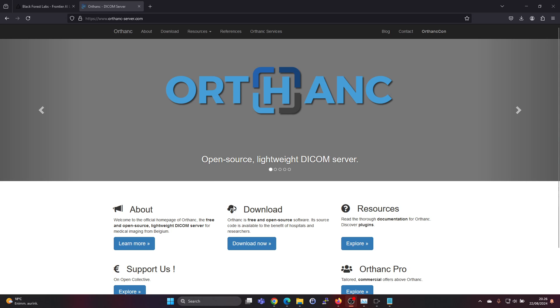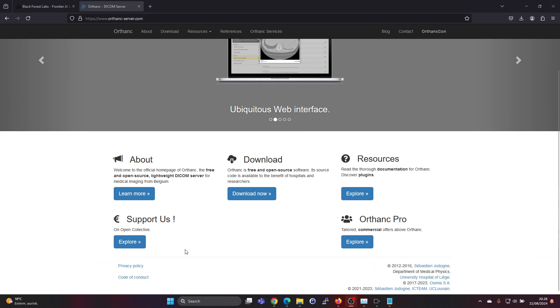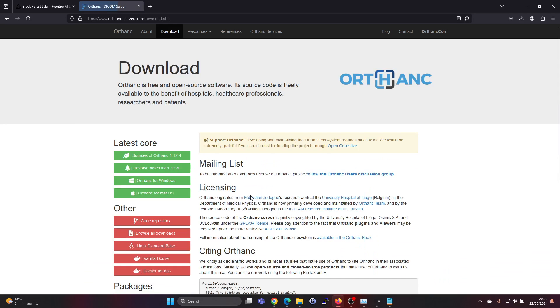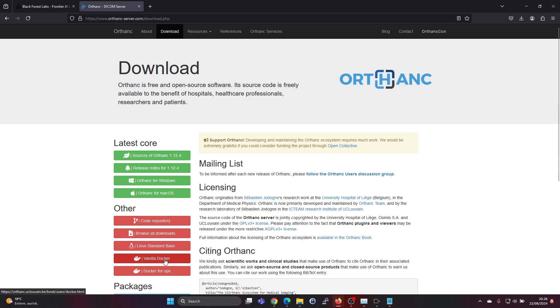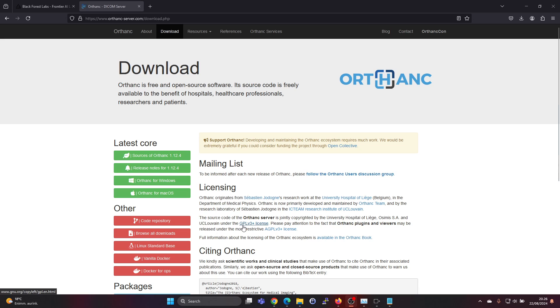Orthanc is a free and open source lightweight DICOM server. You can find installers for Windows, Mac OS, Linux installation, and Docker installation options. You can also find the source code for this. This is GPL version 3 licensed.